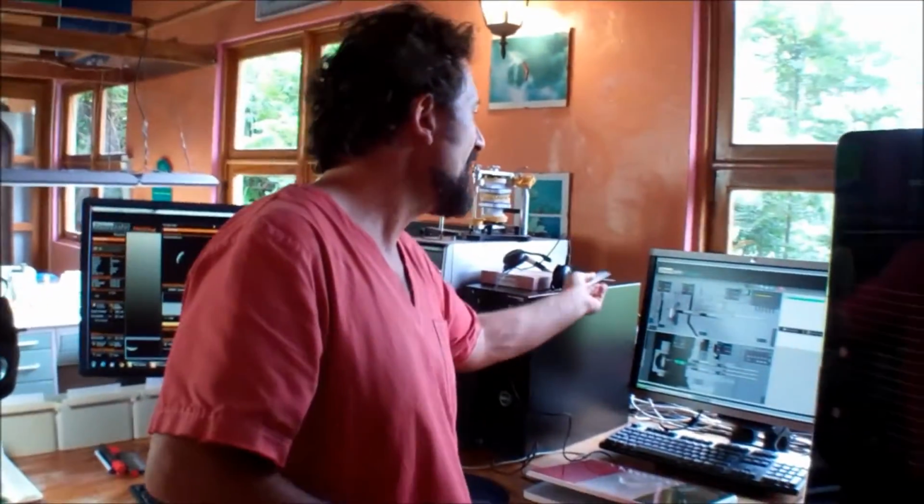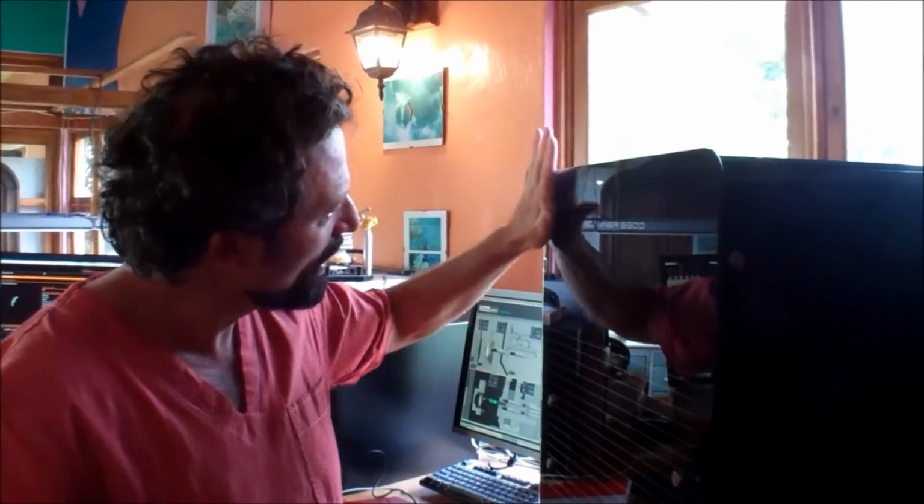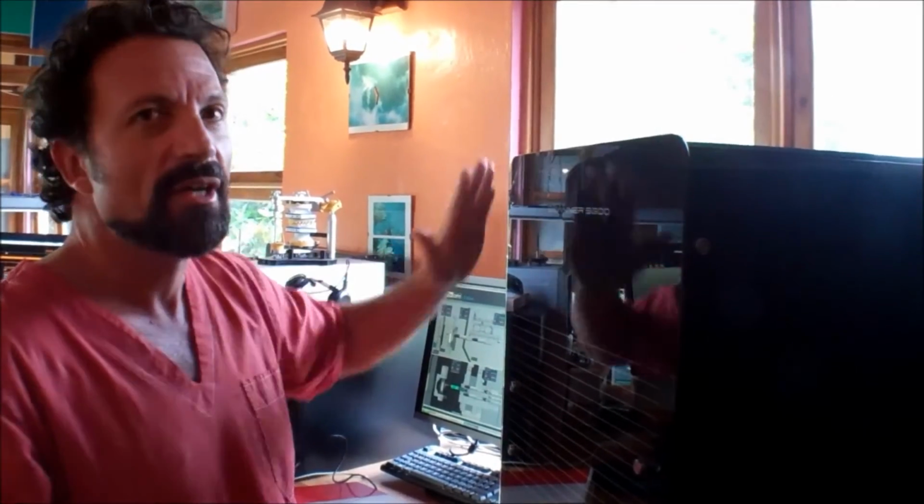Not only that, we're going to put a kind of glaze on top of the material. So when you start to grind your teeth, you're not going to lose material of the antagonist, because it's going to be like glass against glass. When it's a very polished glass, and I put a very polished glass here, and I do this, you're not going to lose materials. If you have sandblasted glass against sandblasted glass, and you start to do this, you are grinding down some material. So our goal is to prepare and leave a very polished and glazed surface on the zirconium. So when you have your bite and your movement, you're not going to wear away materials against the tooth. That's the main point.